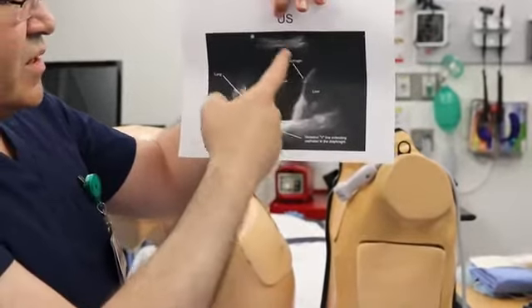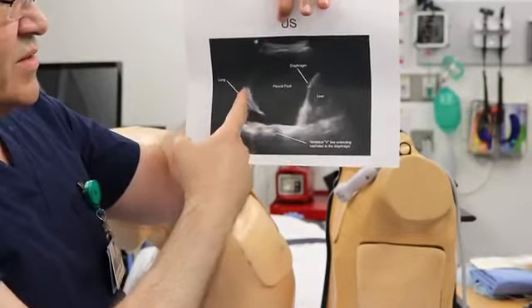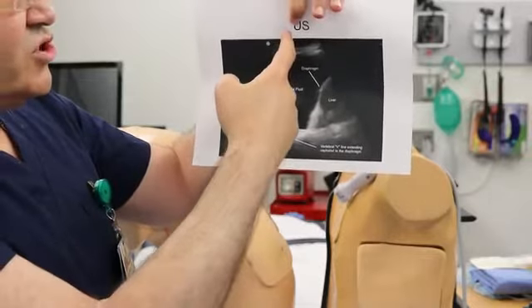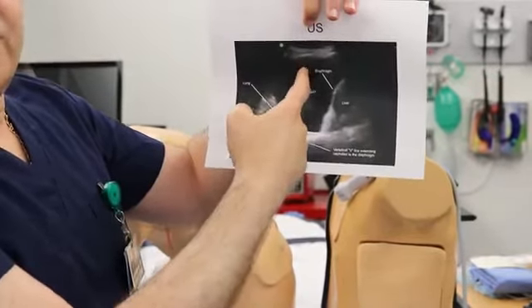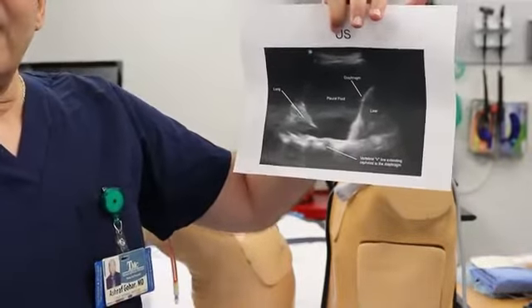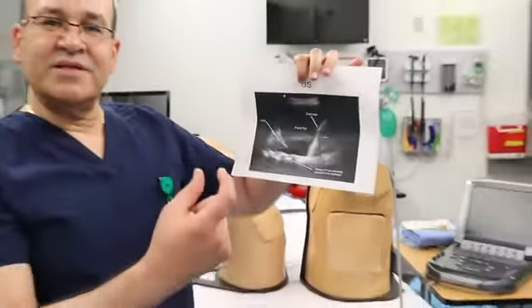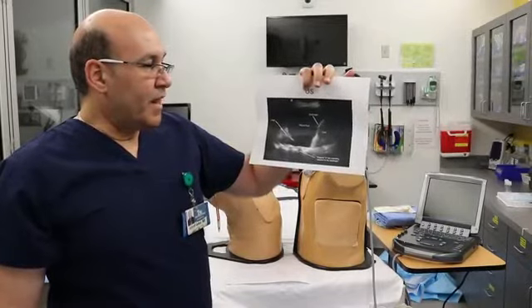And also, you need to pick the position above the diaphragm and below the lung. This is a very good spot. You can go here to get this fluid. You should measure the depth from the skin to the fluid, how deep you will need to go with your needle. Before you start, you know, I go 3 centimeters and I will get fluid. So when you go with your needle 3 centimeters, you should get fluid. So this is very important.